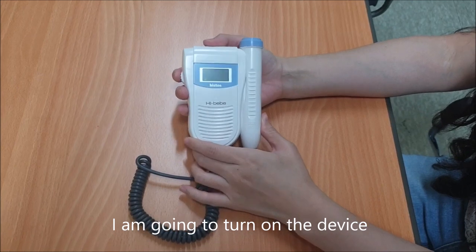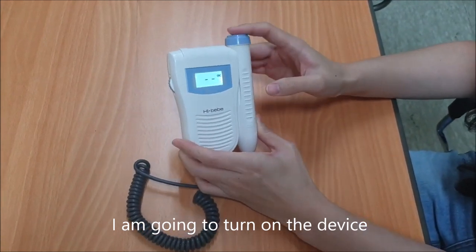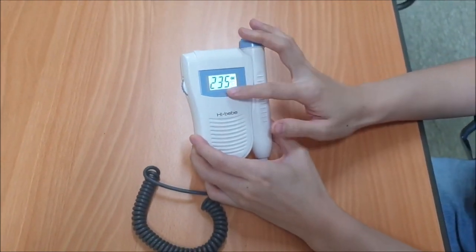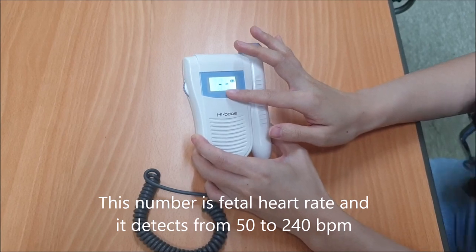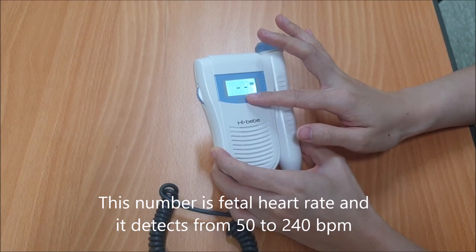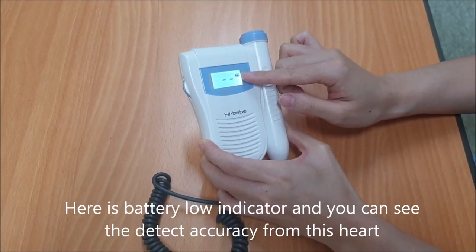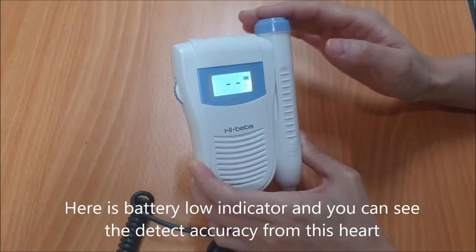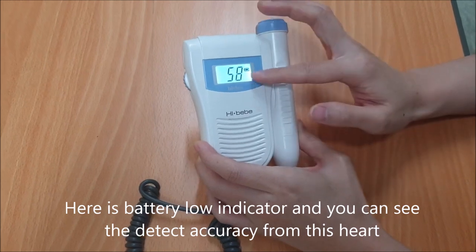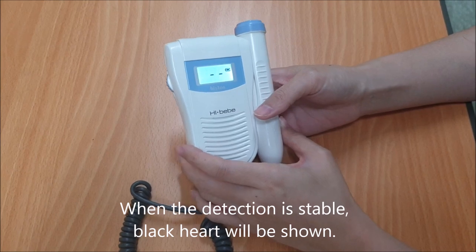I am going to turn on the device. This displays the fetal heart rate and it detects from 50 to 240 BPM. Here is the battery low indicator, and you can see the detection accuracy from this heart icon. When the detection is stable, a black heart will be shown.